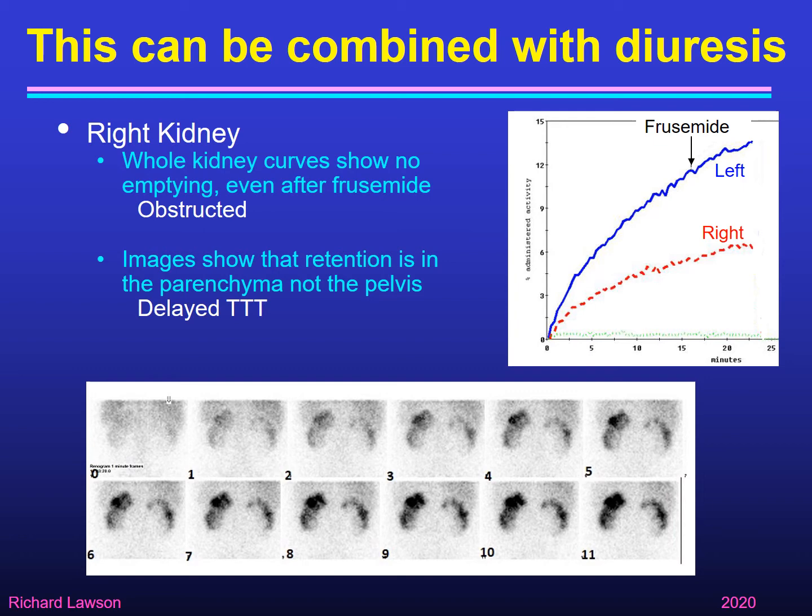And this technique doesn't prohibit the use of furosemide because we're not doing deconvolution. We don't need to do the calculation of transit time numerically. It doesn't rely on there being a constant flow rate. So you can combine this visual technique along with diuresis renography.